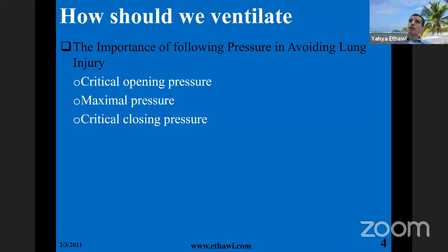There are points during ventilation that are very important. The first important point is the critical opening pressure. The second is the maximum pressure before we reach hyperinflation. The third one is the critical closing pressure.